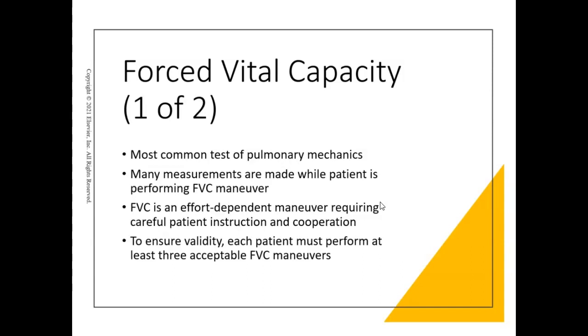In all of the PFTs I've ever done, I've maybe only had 2 patients where I was just like, nope, I'm not getting anything from them. They're not cooperating. Then I would document that in the chart for the doctor, so that when they look at those results they know they're not the patient's best effort.